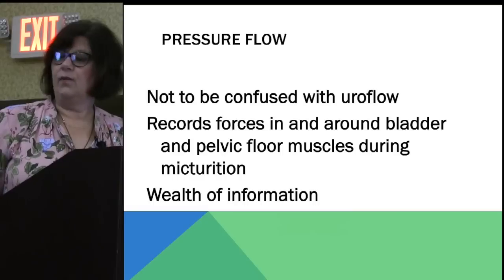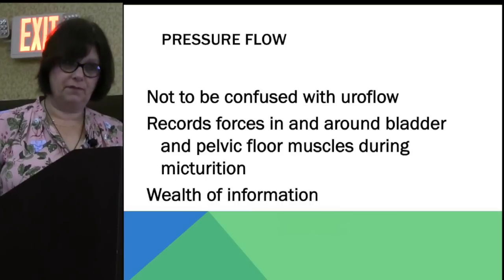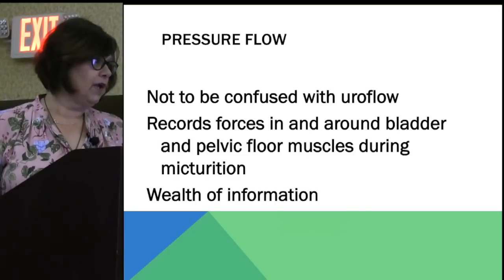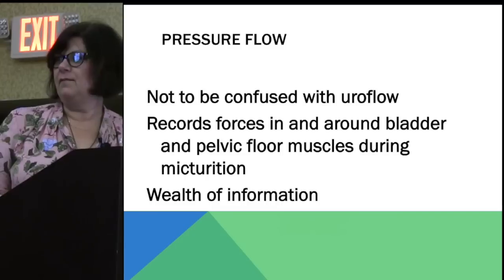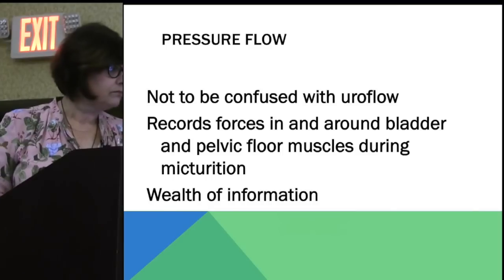And we will see various patterns when you see men with BPH. So they have a prostate that's obstructing, a great flow, like a nice bell curve uroflow. So the pressure flow, you can get many, many pieces of information from that alone.